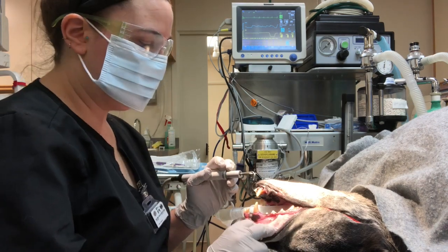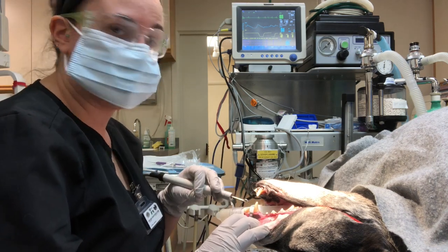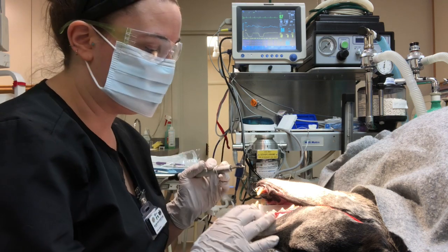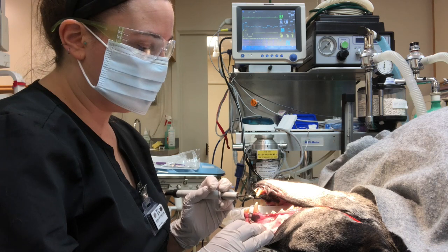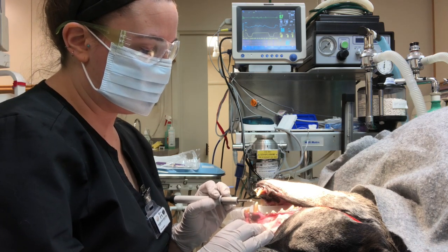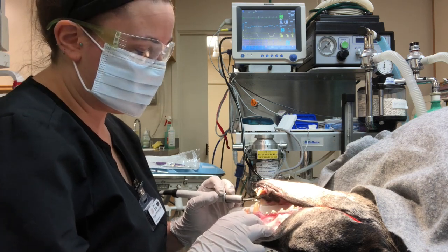When we do ultrasonic scaling, we want our scaler to be parallel to the tooth. We don't want to go at a 90-degree angle because the heat of our scaler can cause enamel defects and defects to the pulp chamber. So we want to go on the side, and we want to use the least amount of vibration from the scaler possible to get the calculus off.